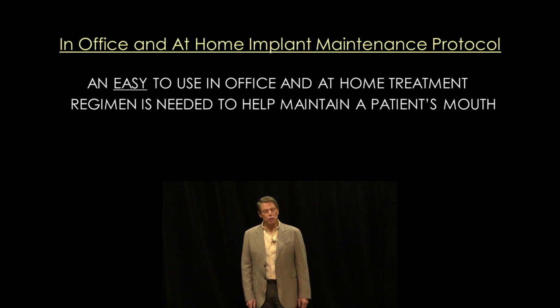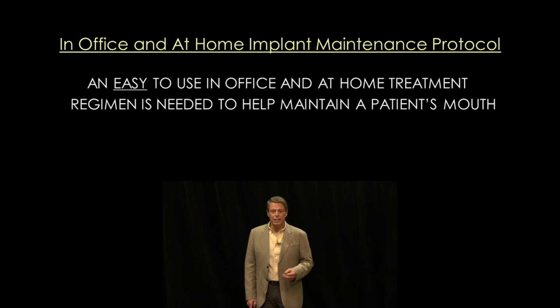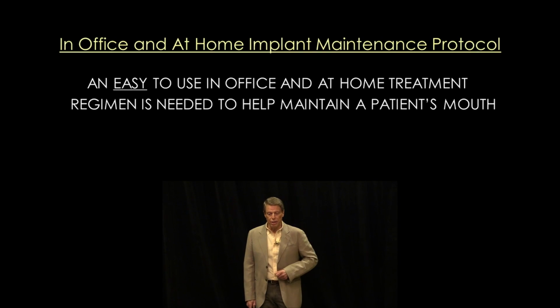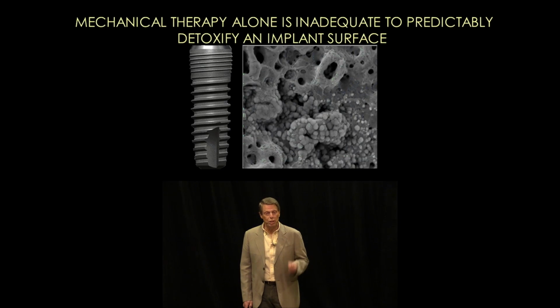Hi, my name is Paul Fletcher. I'm a periodontist and a member of Specialized Dentistry of New York. What I'd like to do is present an evidence-based, in-office and at-home treatment regimen for the maintenance of dental implants. Because of the macroanatomy of the dental implant threads and the microanatomy of the dental implant surface, mechanical therapy alone is inadequate to predictably detoxify an implant surface.